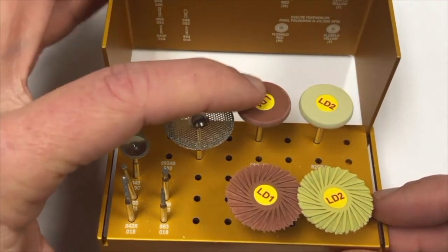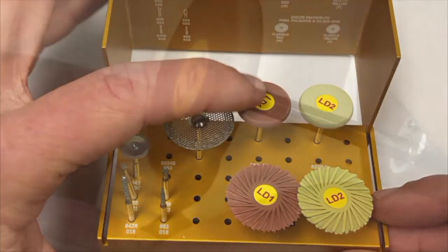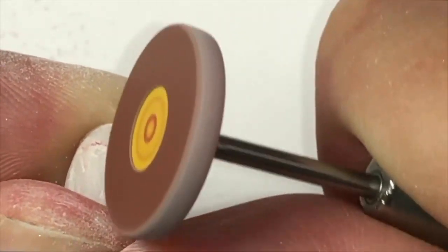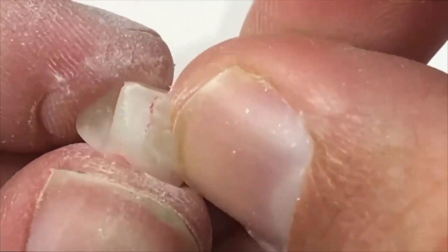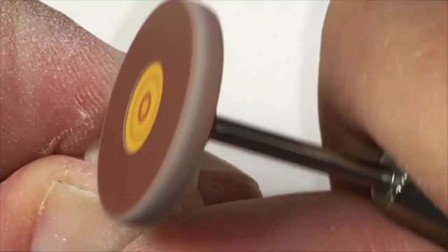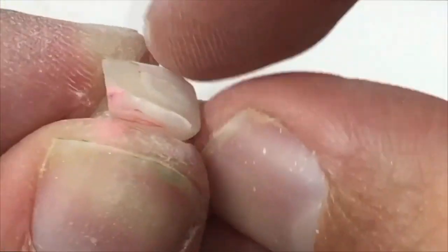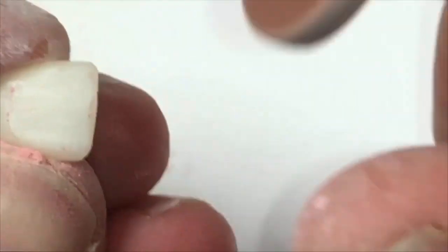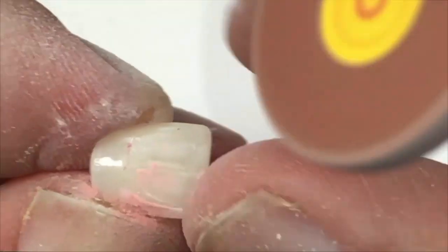Once contouring is complete, the initial finishing and polishing of the line angles and facial areas of reflection is done with the Dialite R20 MLD Red Wheel. These Dialite polishers are composed of durable diamond-impregnated rubber ideally suited for polishing ceramic surfaces, and are more efficient than conventional wheels due to their diameter and thickness. The medium LD1 Dialite Wheel is used to polish the area between the line angles and the contact point, below the height of contour, and then the other grind zone area. It is important to polish the facial surface in an up-to-down fashion to prevent polishing the low depressions and only polish the reflective surfaces. The ideal RPMs for the medium Dialite Polisher is 6,000 RPMs.